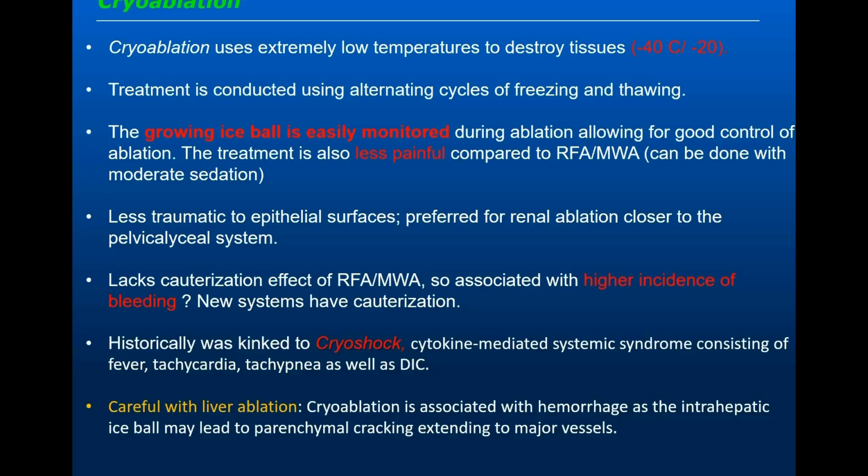But the good thing about this modality, and it's really a big blessing, guys, is that you can easily monitor the growing ice ball. Unfortunately, with microwave and radiofrequency ablation, especially when you are using CT, you cannot really see the burn. You can predict how big it will be based on some charts that come with the device, telling you if you use this probe, you will get 2 centimeters.